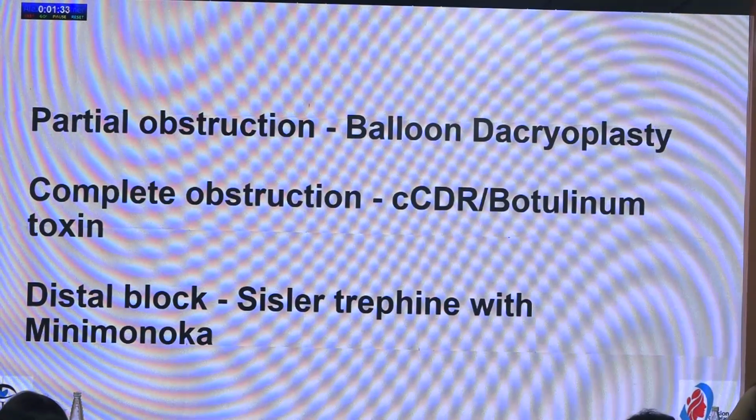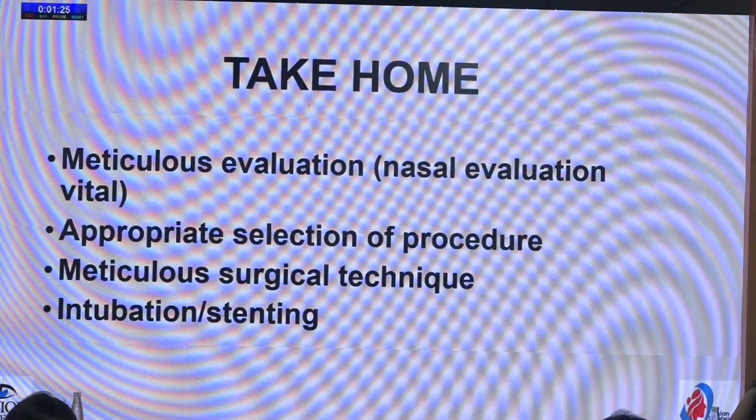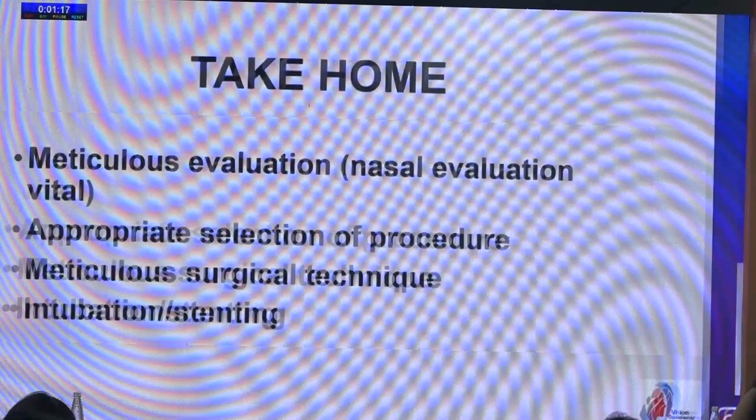And there are non-invasive methods like balloon dacryoplasty, etc. But these don't really work well for any revision cases. So meticulous evaluation, get the ENT person involved, meticulous surgery, and definitely a stenting.